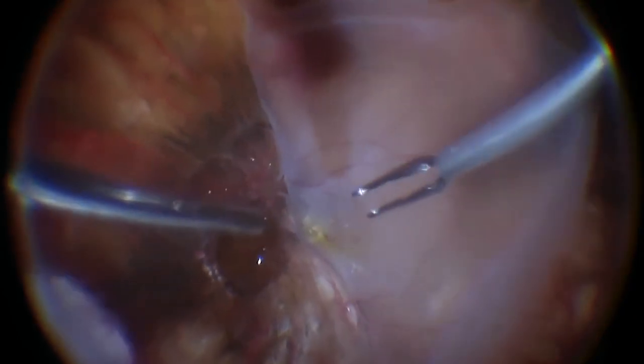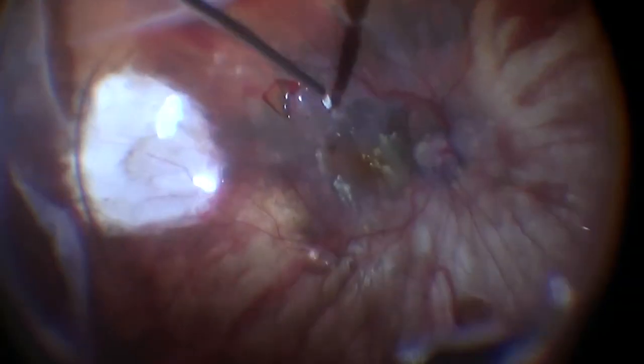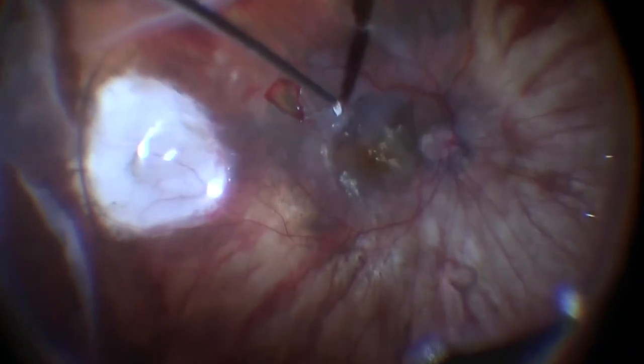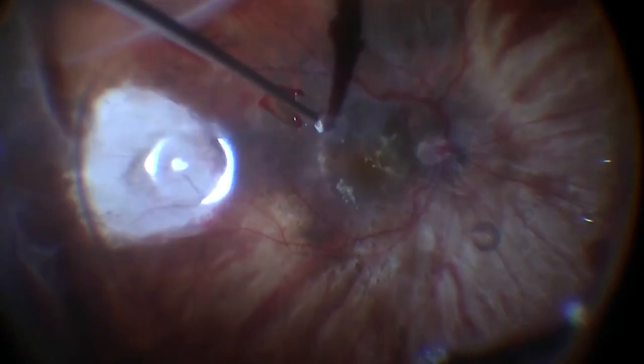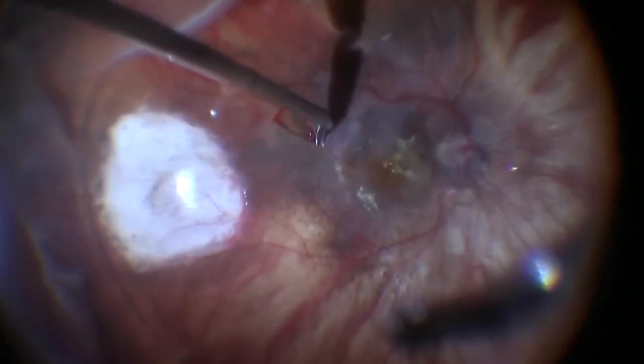So I decided to perform surgery, which actually made more sense. I isolated a patch of retina from the equatorial area. I flattened the retina with PFCL on top of the retina. And then I moved the patch into the macular hole, as with the technique of Tamer Mahmoud for the macular holes.